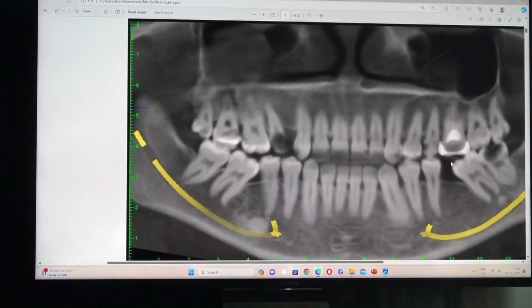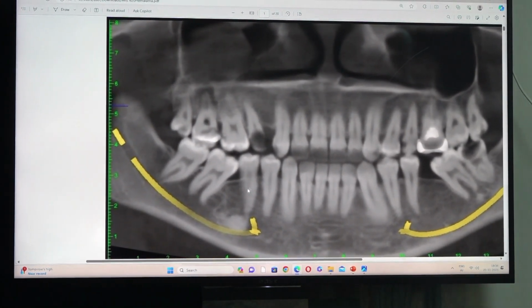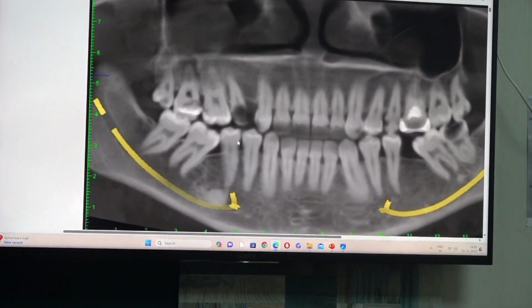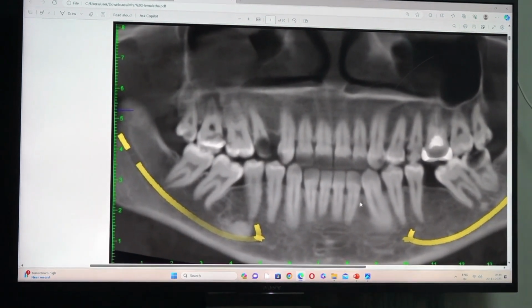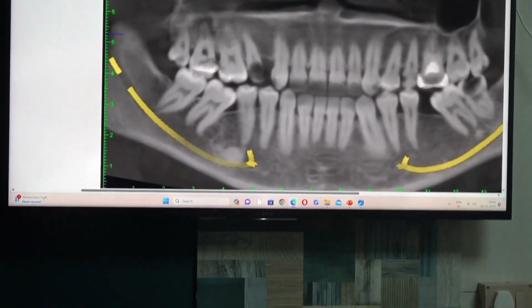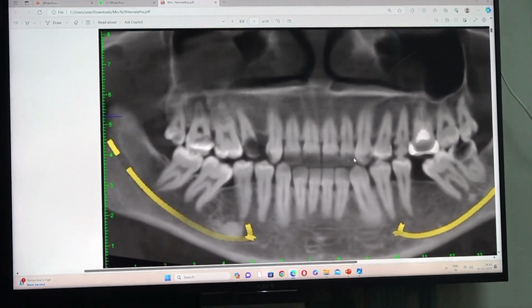If you see a lot of decayed teeth, some wrong habit is there. Maybe a lot of sweets or raw rice eating, something is not right. From a young age, the patient has had this habit. See, this patient lost the 4-6 at a very young age. The 7 is mesially tilted and even closed the space. After the patient loses the 4-6, the patient lost the 3-6. Maybe in the time the patient lost 1-4, but the patient is not stopping her wrong habits. That is the reason for a lot of decay, root canals, even the 8 is decayed.